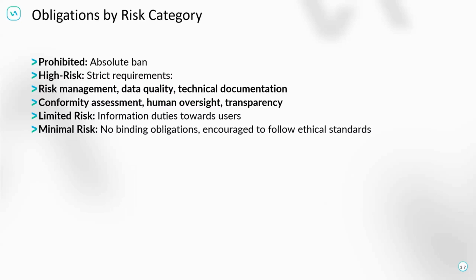Limited risk has at least the transparency requirements to show this product can be used with AI, it uses AI, and shows in that circumstances AI has the following prediction, calculation, and knowledge it gives you. And then we have the last one, which is the high-risk product, which has very strict requirements. So risk management, as already explained.